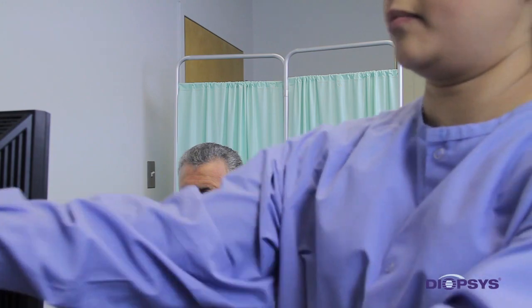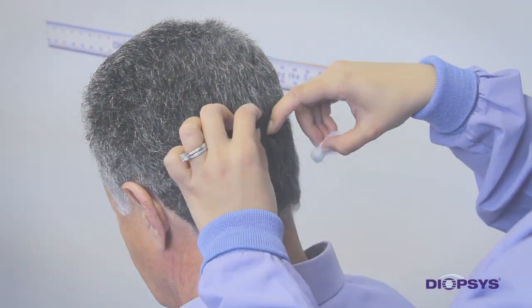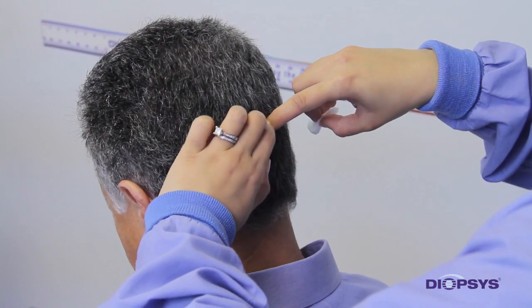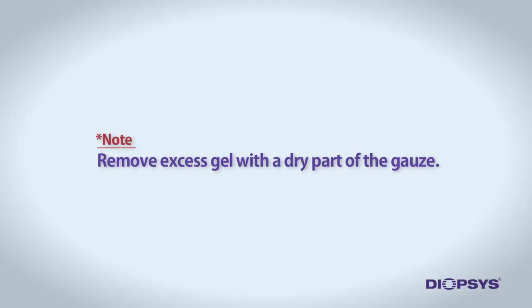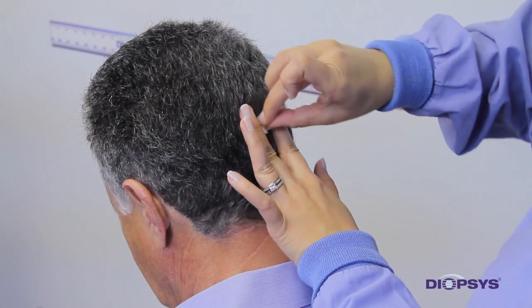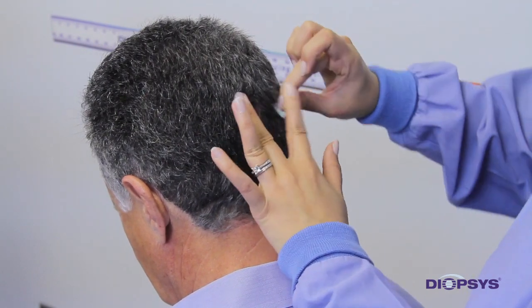On another piece of gauze, apply a pearl-size amount of the NuPrep gel. Keeping the patient's head straight, follow the spine up to the patient's inion — the small bump on the back of the patient's head. About a finger's width above the inion is where you will prep the patient and place the electrode. Once you have located the proper location on the back of the head, gently part the hair and rub the gel onto the scalp to thoroughly cleanse the area. Keep in mind that the back electrode is the most important site and therefore attention to detail is imperative. The scalp is thicker at this location, so harder scrubbing is necessary to achieve good conductivity.